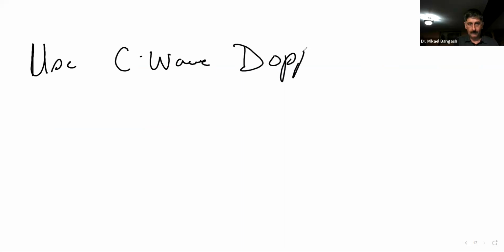Now, ladies, the last thought on aliasing was to use a continuous wave Doppler.